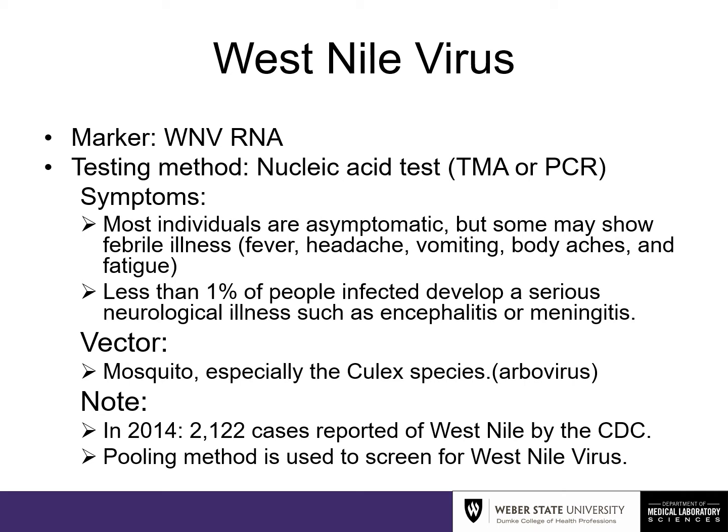So if there's a positive within that pool being tested, then there will be individual testing that is performed afterwards. This saves the laboratory money and time by not screening every individual person.